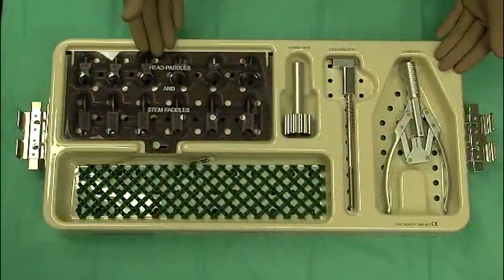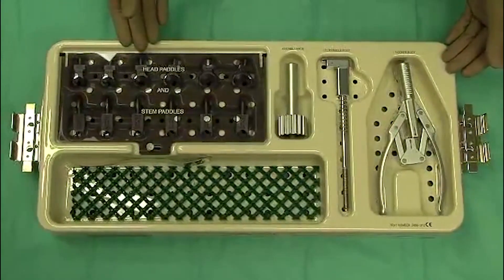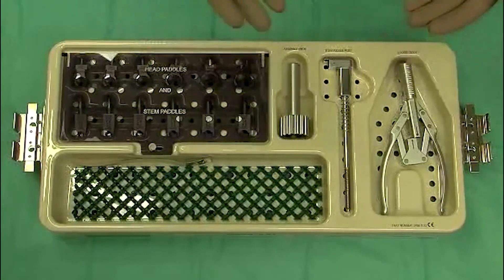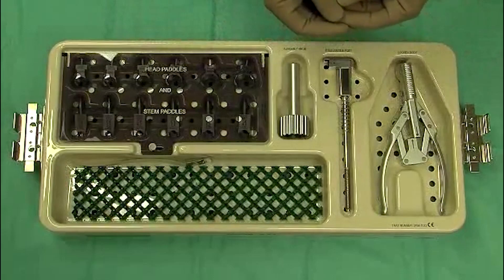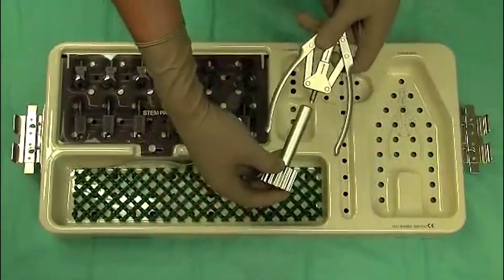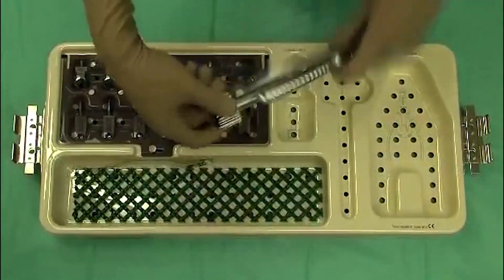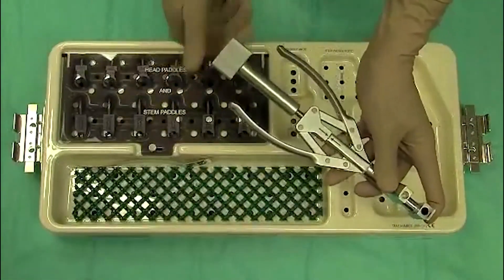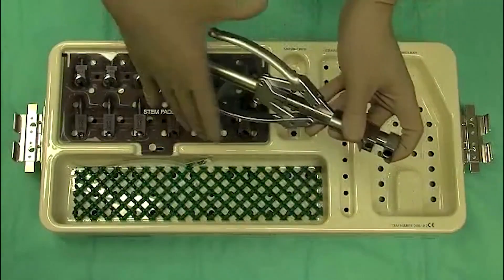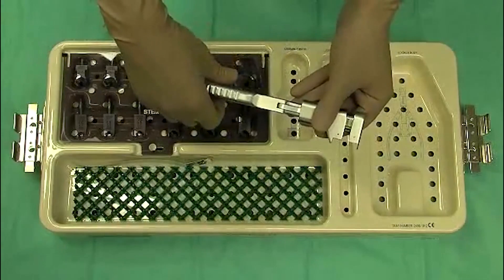These are the Evolve ProLine locker instruments, in a separate tray from the standard system since it is uncommonly required. This is used in an elbow which is very tight, where the radial neck cannot be delivered laterally to put in a monoblock implant. You put the radial stem in first, then the head, and couple it in situ. This is put together on the back table very quickly, and provides a very effective way to compress the Morse taper together in situ.